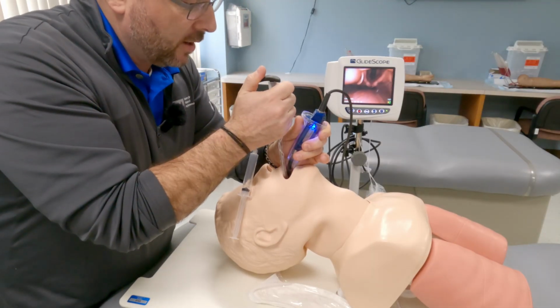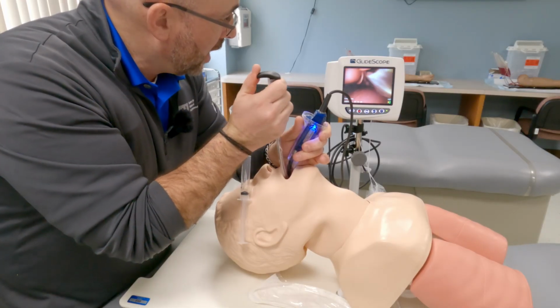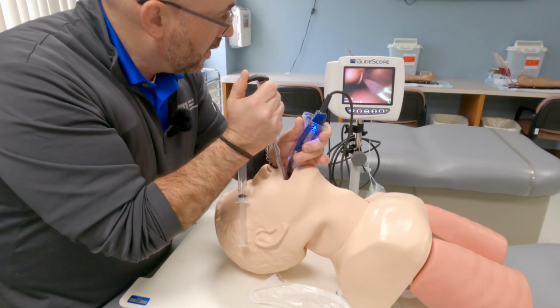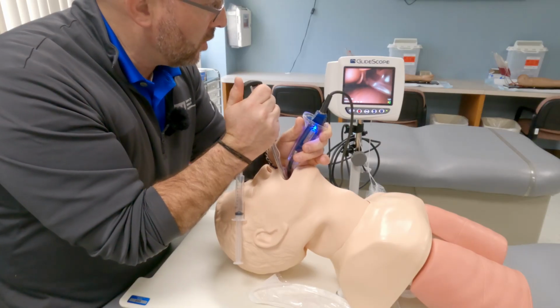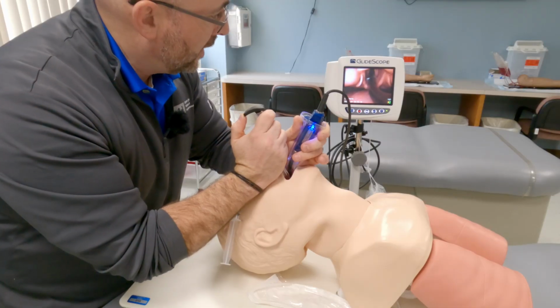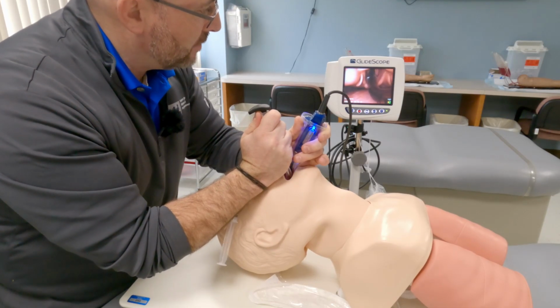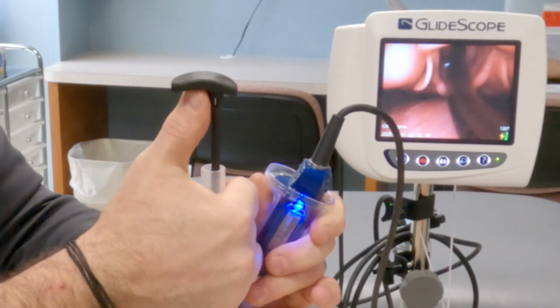Grab this piece right here. I'm going back to the monitor now. Now I can start to control it. I control it with my thumb on this, what I would call a joystick. I insert it to here. I'm still on the monitor. At this point, I'm in the cord. I'm getting past the cords. Not past them yet. I'm going to pop this up.